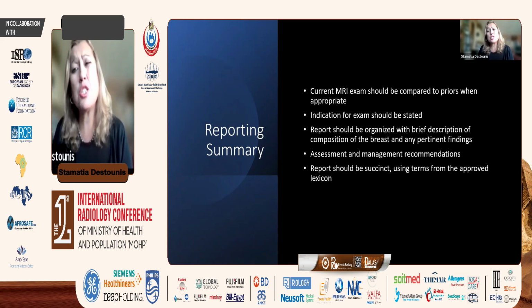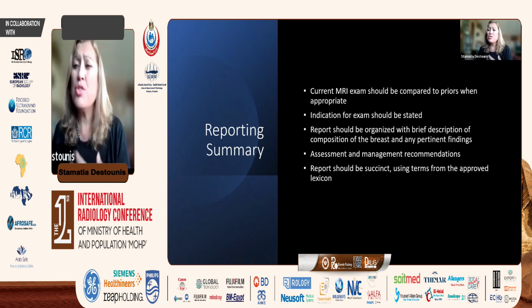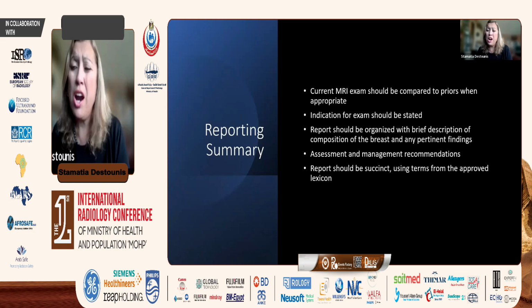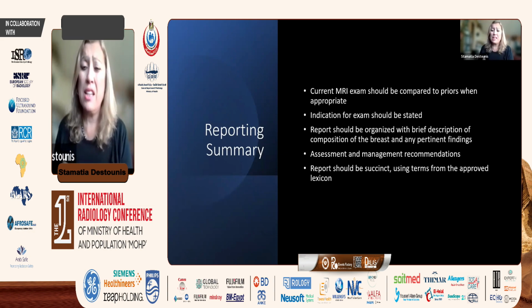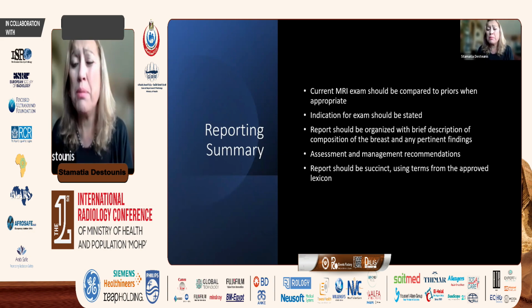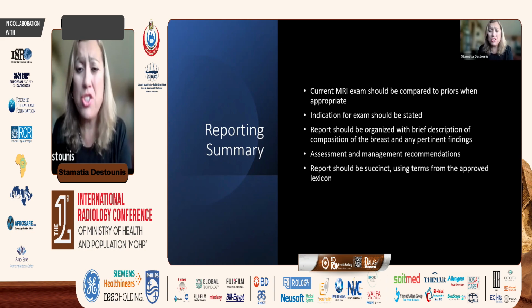The report needs to be succinct, easy to understand, using approved language from our MRI lexicon and our BI-RADS atlas, because somebody is going to take a look at this and perhaps follow that patient a year from now, another radiologist. So we all have to be speaking the same language so we all understand what this reporting means and give the help that our healthcare team needs to take care of this patient.